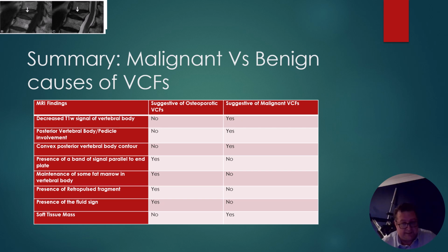So I'm not making the diagnosis, that's really important. Normally where I am, it would come up with something like a red star report, and then the job is to liaise very closely with the GPs, and the GPs usually then do the necessary things. I do not diagnose cancer. I know I keep saying it, but it's really important.